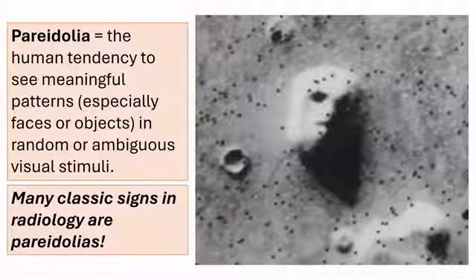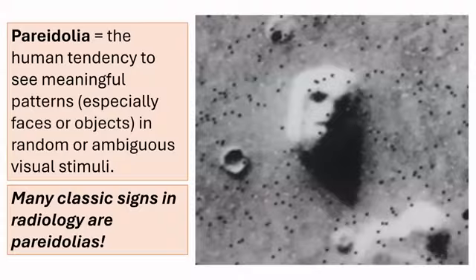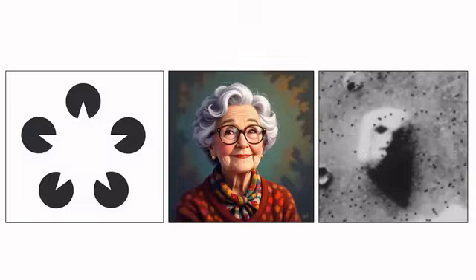We are going to see a lot of signs called, like, the panda sign or the hummingbird sign, because we are looking at something on our scan that looks like a hummingbird or looks like a panda, something like that. And we're going to encounter a lot of animals in this presentation. So without much further ado, this was the introduction. Let's jump right into it.